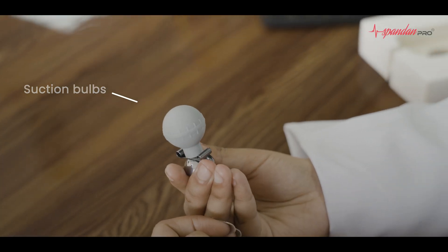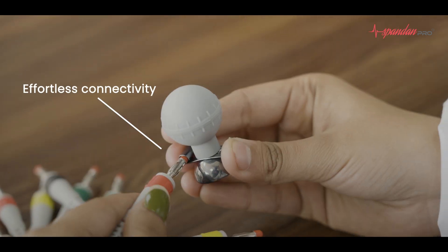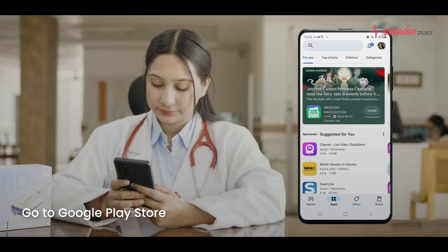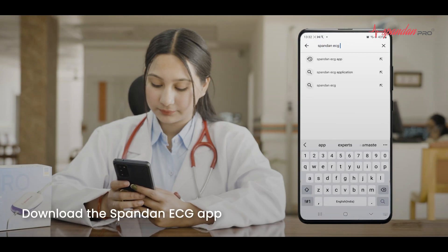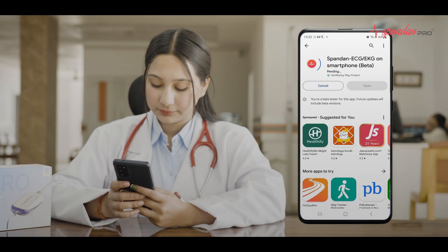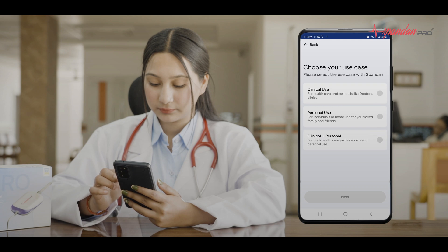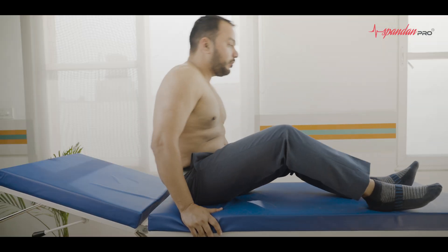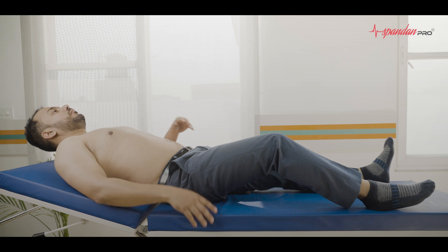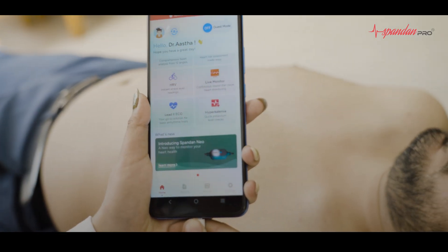Connect the chest leads with the suction bulbs. Go to the Google Play Store and download the Spandhan ECG app. Open the app, choose your language, select your use case, and connect Spandhan Pro with your smartphone.